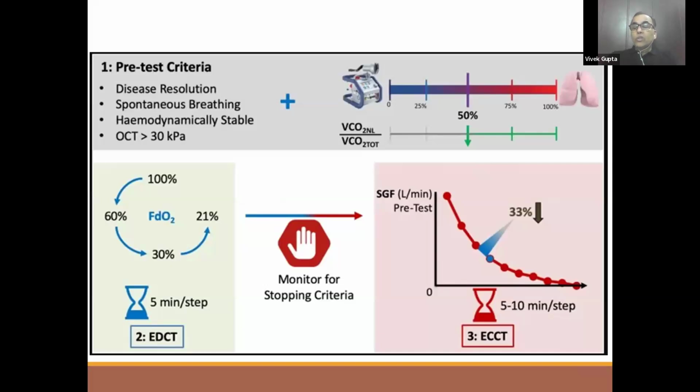So different tests are also performed. You do an oxygen challenge test, where you increase the FiO2 on the ventilator to 100%, and then you do it for 5 minutes, and then you check the PO2 level by doing an ABG, and you keep repeating it. That will give you a good trend guide of how much PO2 is improving. That's what the oxygen challenge test is.